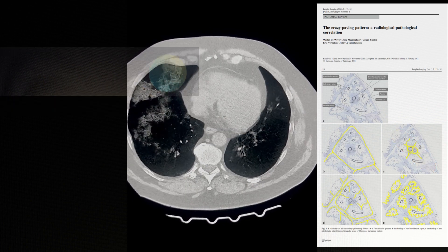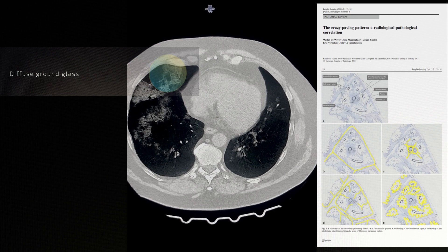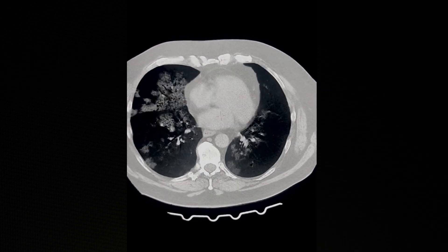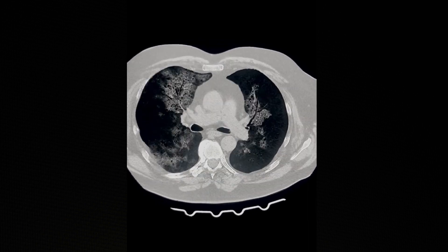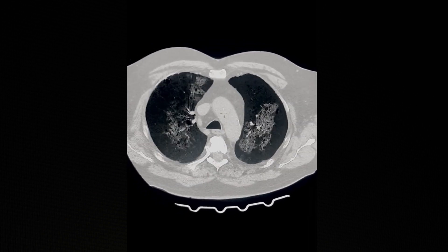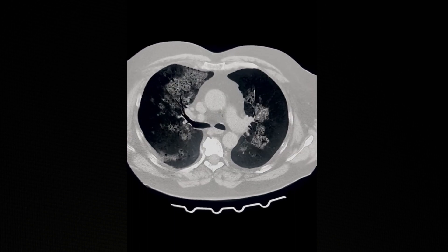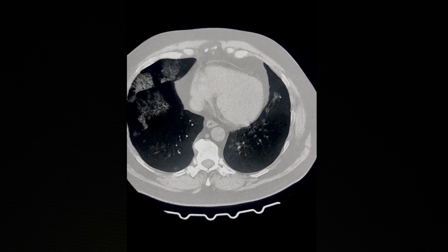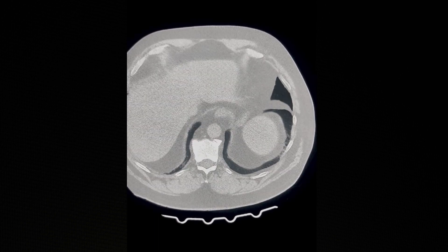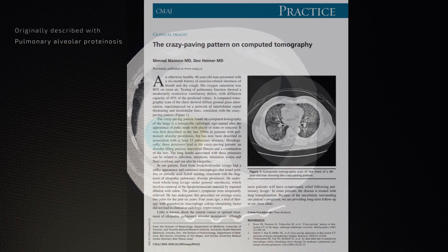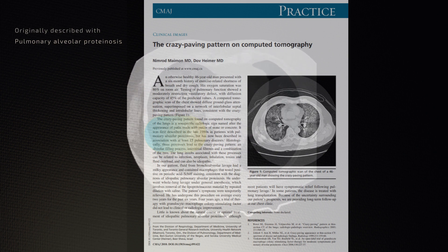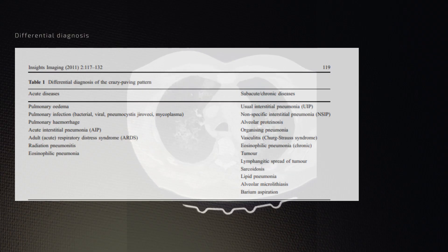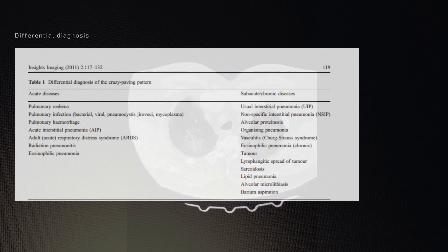When this progresses further, it is also replaced by areas of diffuse ground glass. The crazy paving pattern can be associated with other patterns or can be manifested on its own as a pure crazy paving pattern. This was classically described with entities such as pulmonary alveolar proteinosis, although it can now be observed with many other infectious as well as non-infectious conditions.